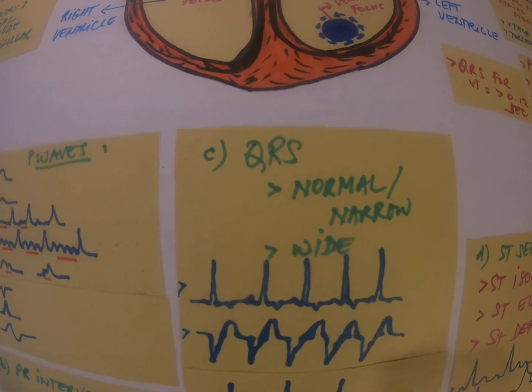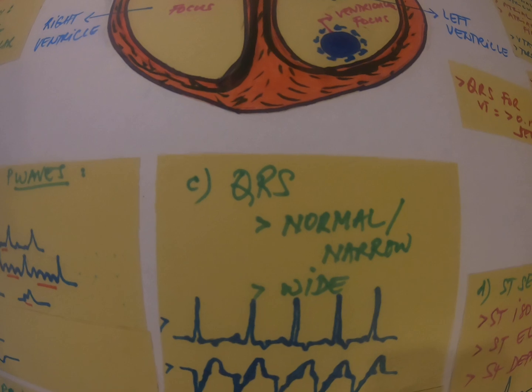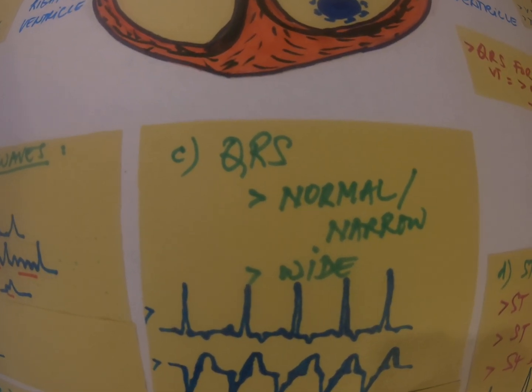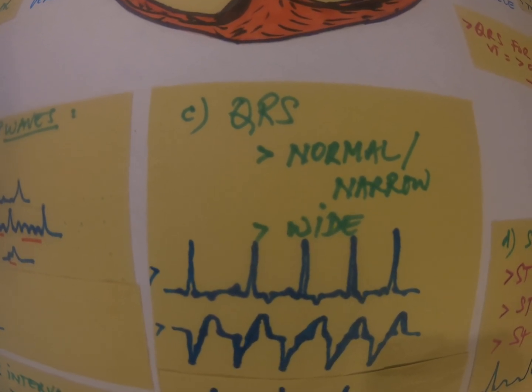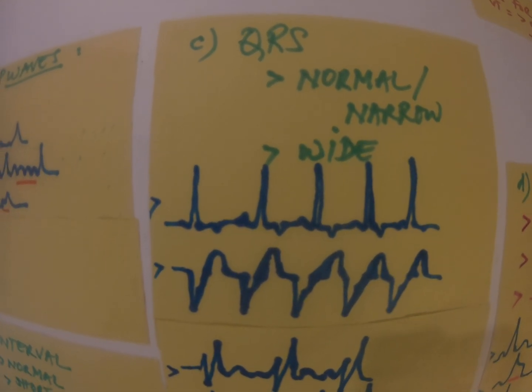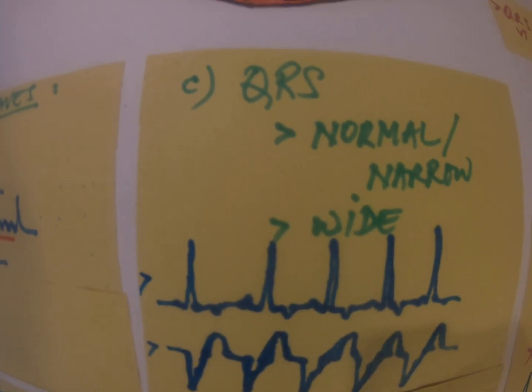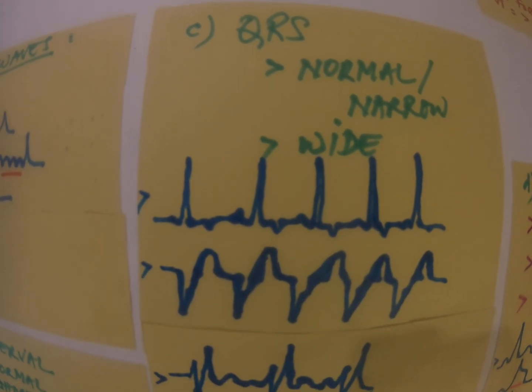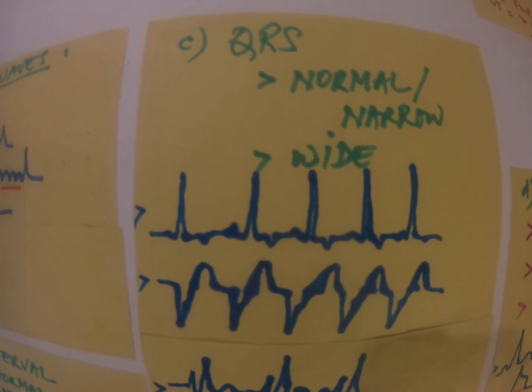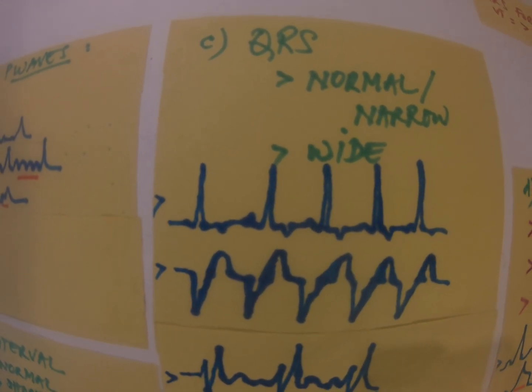Next is QRS. The QRS could be normal, and usually it's equal to or less than 0.10 seconds. They could be narrow, which is expected, but when they got tachycardia, they will say, is it wide or narrow? So wide, are we dealing with bundle branch block in here? So the first one is a normal QRS in here. Next one, we have wide. So is this VTAC or is it just bundle branch block? There are parameters to consider, but the mere fact it's wide.